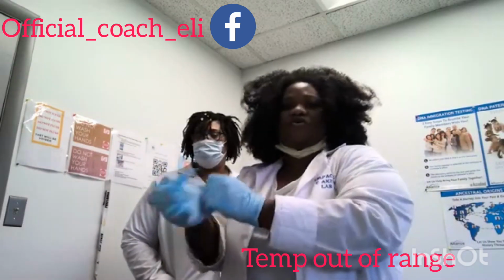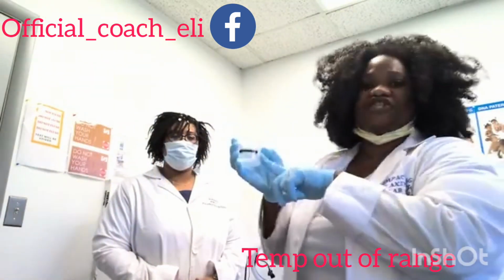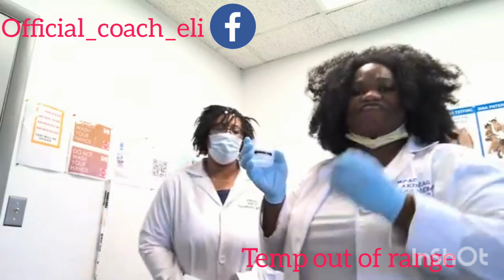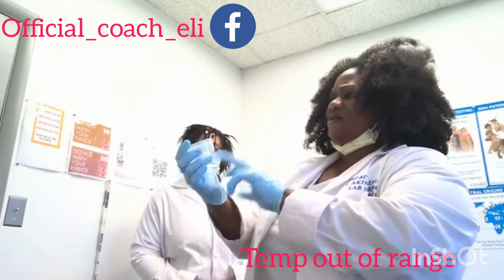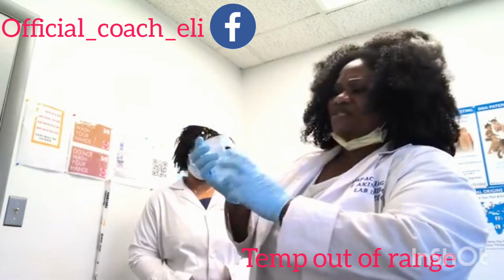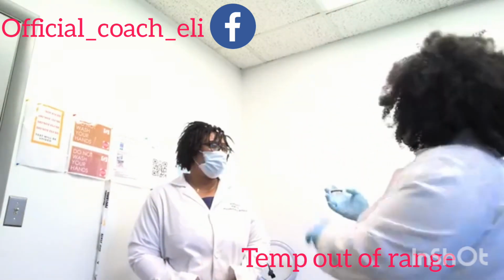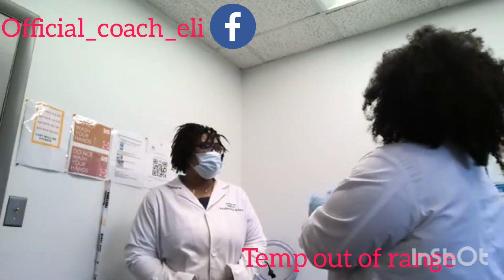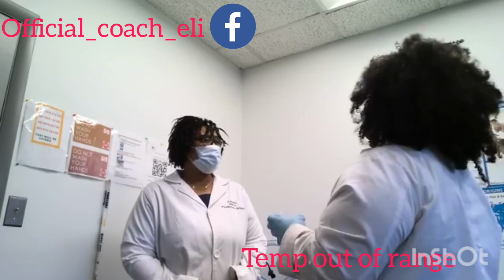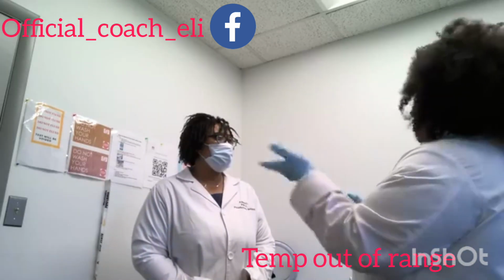All right. So what I want to do at this point is to make sure I'm checking for what? The temperature. I want to make sure the temperature is in range. Remember, this is temperature out of range. So when she comes back, the temperature is not within 90 to 100. It's out of range. So what's going on? Well, Miss Ashanti, your specimen temperature is out of range. What that means is that we would have to do another test, which is called direct observation. I would have to directly go with you to the bathroom to observe you. But we're going to finish this test because I still have to do this test.